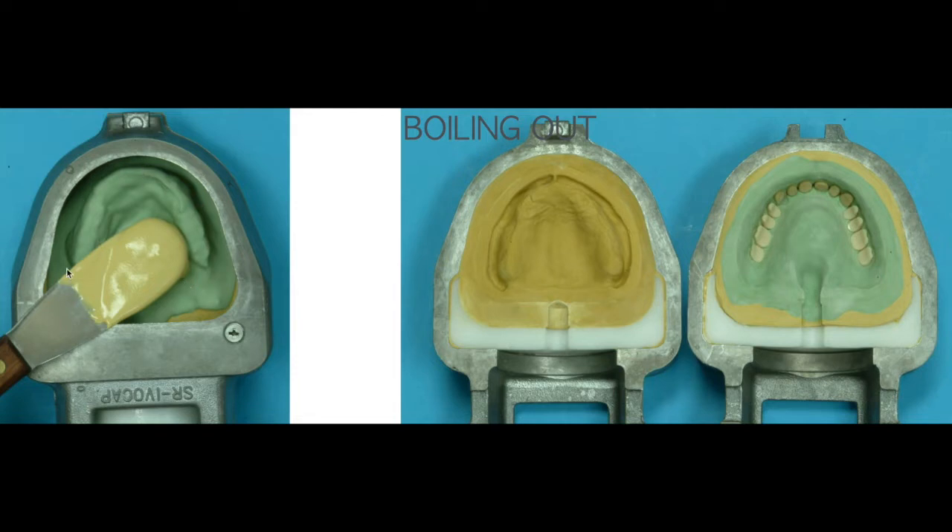This is how it looks after boiling out — meaning after you put the stone and then leave it in boiling water, it makes the wax all melted down. You can then disassemble the flask unit into bottom and top, and the wax is all washed out, but you still see the denture teeth.